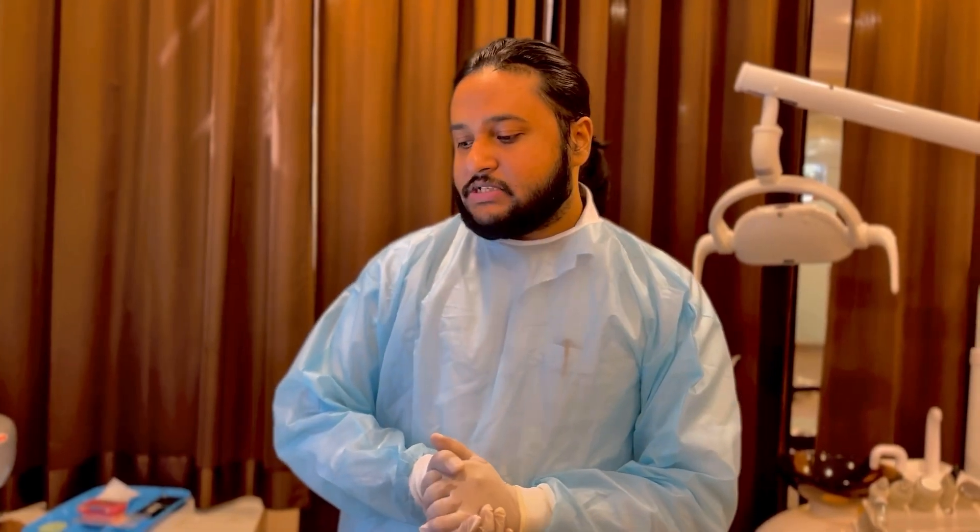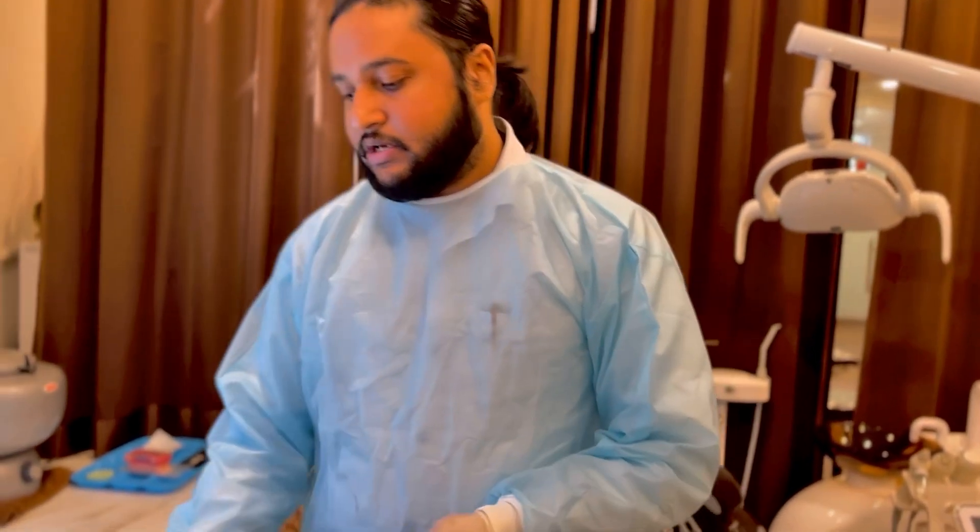Hi everyone. As we have already informed, we are coming up with a video lecture series on contemporary implant dentistry. As part of this series we will be giving some practical demonstrations. In this video we will be demonstrating how to manage bleeding complications during an implant surgery, focusing on cauterization of vessels. Let's head to the demonstration.